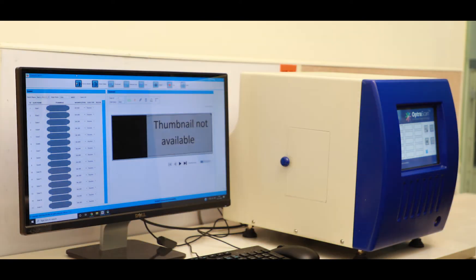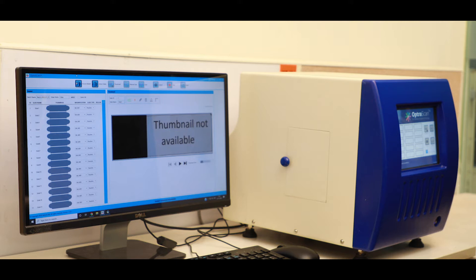Today I'm going to give you a quick walkthrough of OptraScan's digital pathology solutions. As you can see here, we have the hardware unit which would be used to digitize the glass slides.